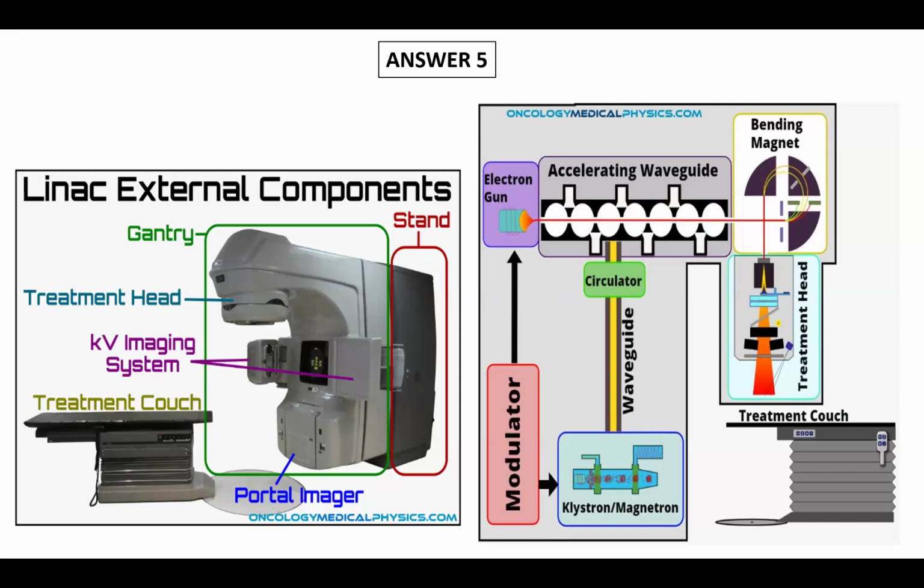Next, actually, in between the primary collimator and the secondary collimators, slowly explain one by one, because this is very, very important. You should know this one. After the primary collimator, what is there? The flattening filter can be placed, sir, because the photon beam which is produced has a forward peak, sir. So in order to get a flattened beam, we will use the flattening filter, which is cone shaped, so that it makes the beam a homogeneous flattened beam.